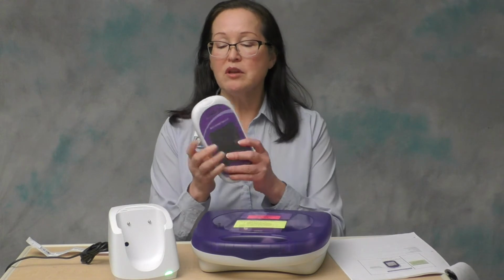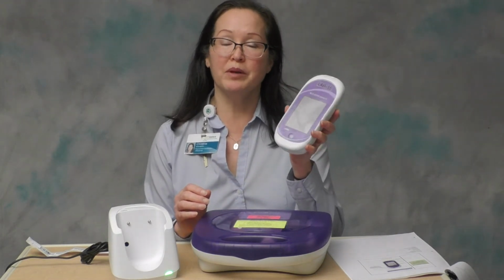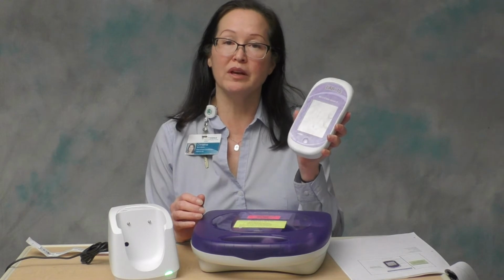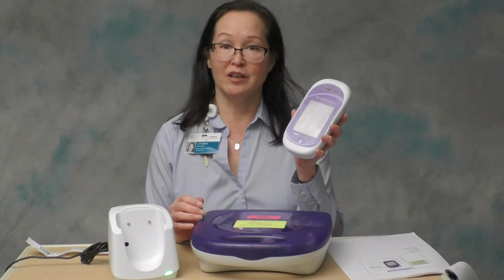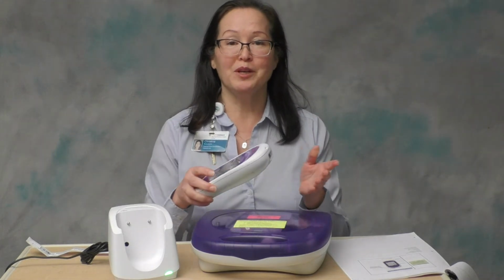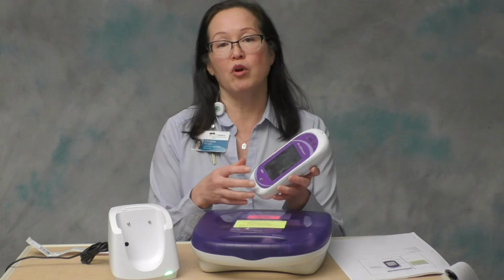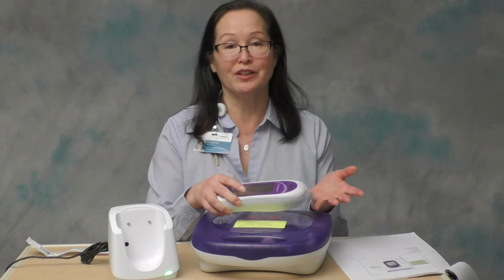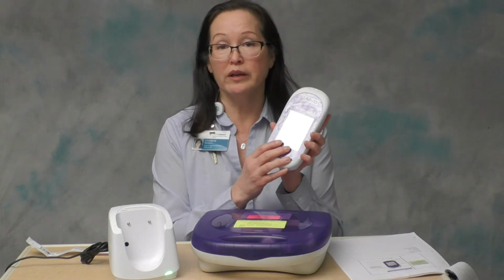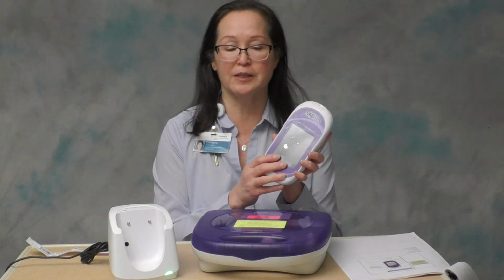So the meter does not have any complicated moving parts to it, but it is a complex chemistry analyzer and computer processor, so it needs to be handled delicately. Never drop the meter or toss it onto a flat surface. As a matter of fact, if the meter gets dropped from any significant height, anything above an inch or more, you actually should run quality control testing on it before you continue to perform patient testing.